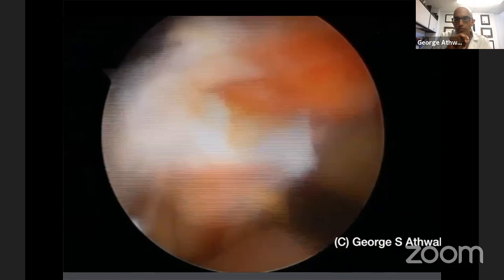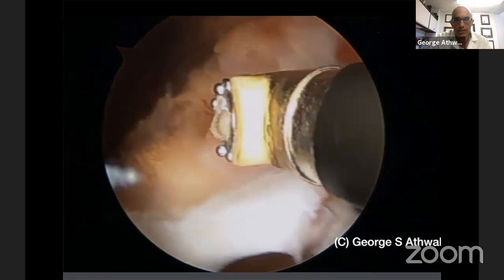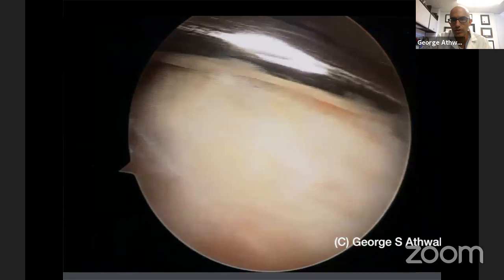So here's the outlet. So there's the fascia, deep fascia of deltoid. The graft is gonna come through the infraspinatus outlet underneath the spine, in through the transosseous tunnel, and I'm gonna flip it over a loop endo button. So we're gonna make our transosseous tunnel.